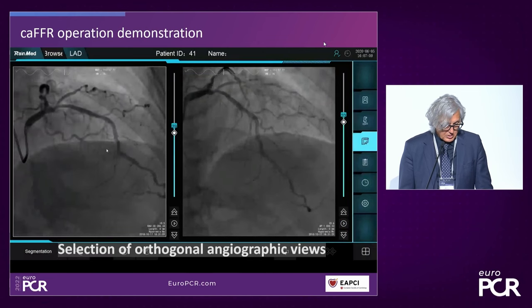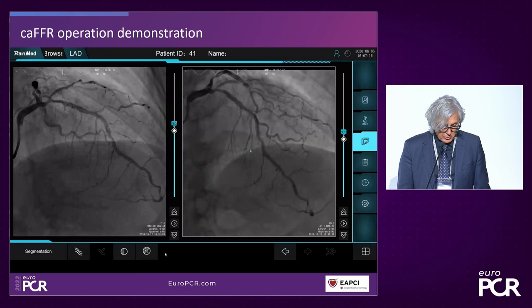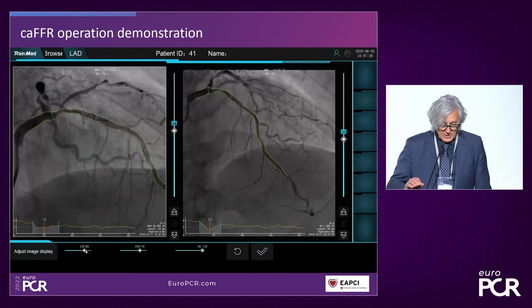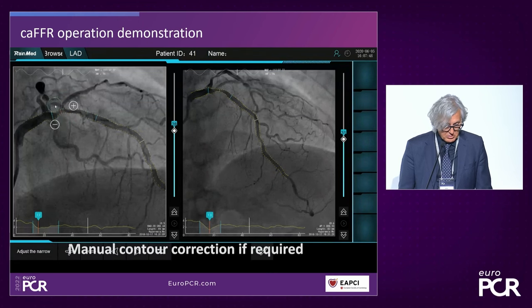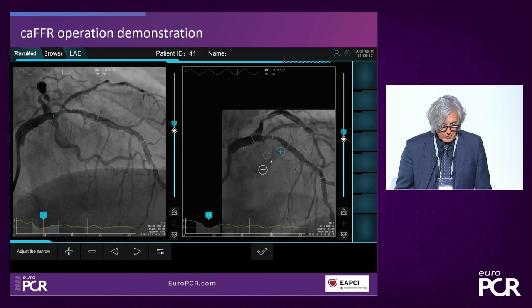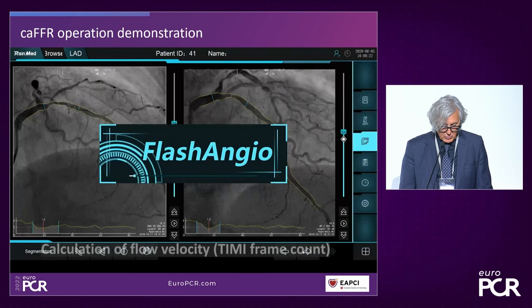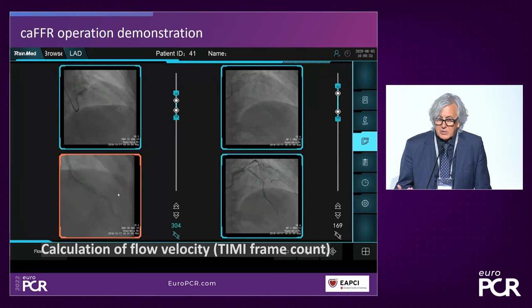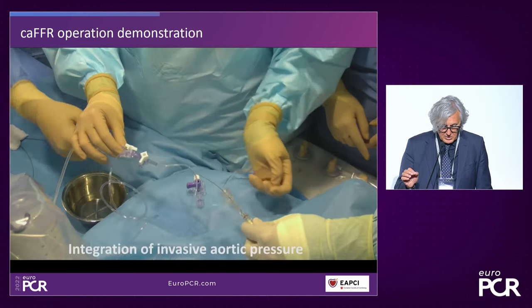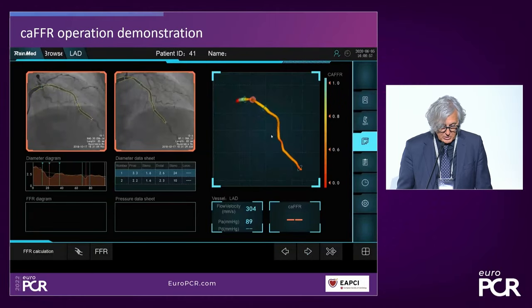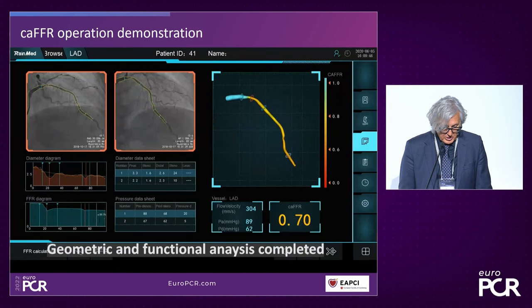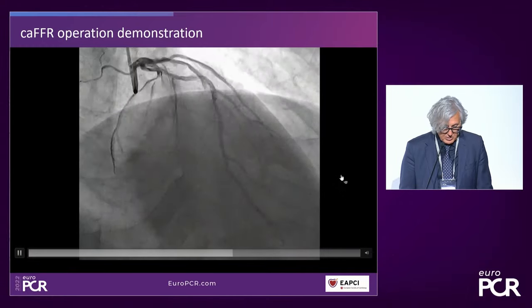The system first requires selecting two orthogonal views. Following that, there is automatic identification of the centerline and contour of the vessel from the angiogram, with a tool allowing refined manual corrections. Once that is obtained, information about flow velocity is entered by selecting frames just before contrast enters the coronary artery and when it reaches the region of interest. Then aortic pressure is entered, and the system automatically calculates CAFFR. You can scroll down in the vessel to review the result.